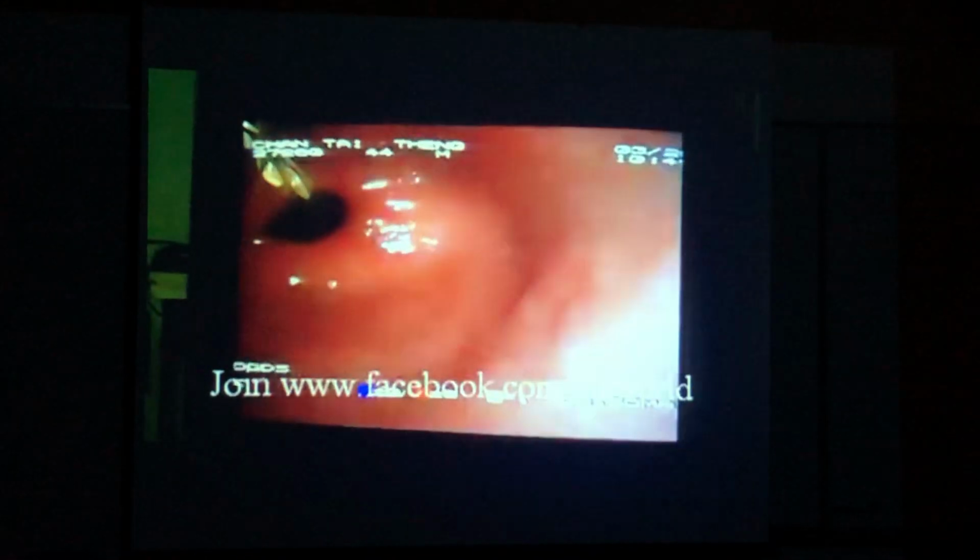Okay, now back into the antrum. If you have the antrum part of the stomach, you're going to take a biopsy to identify whether the patient has H. pylori, which is part of the infection in the stomach.